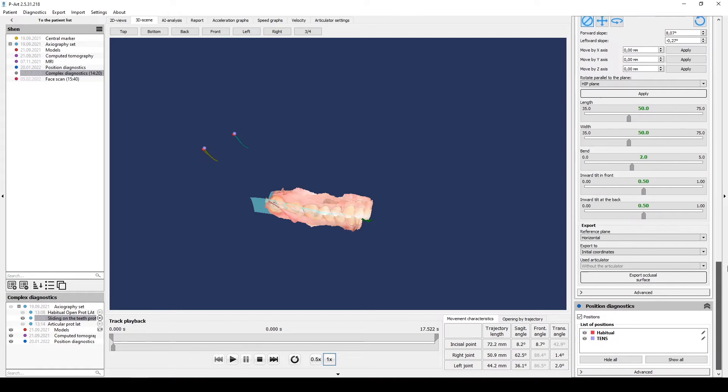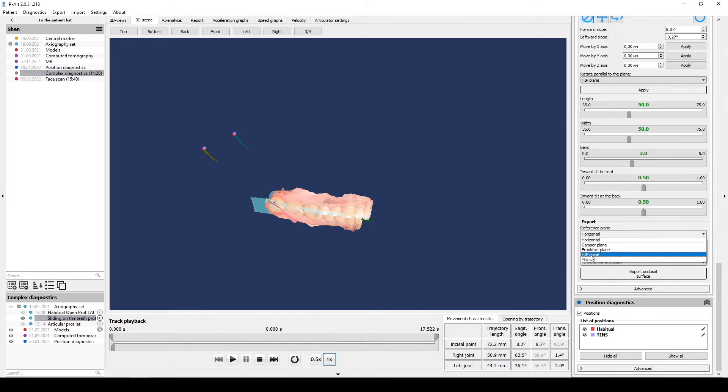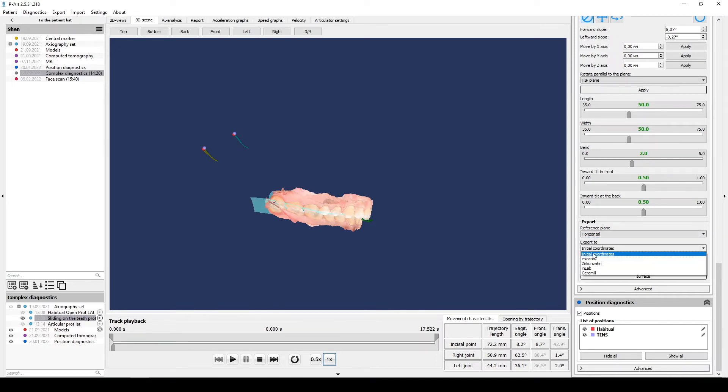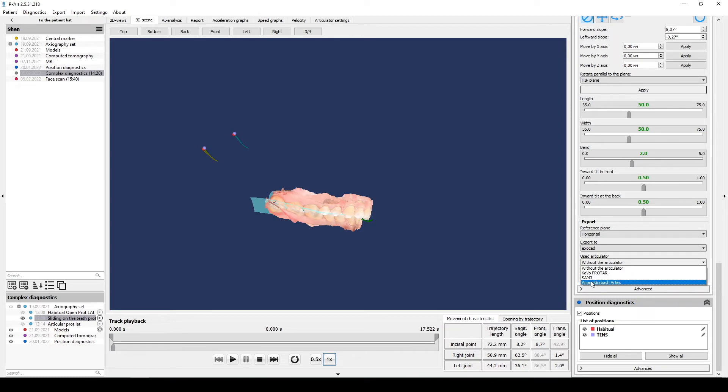After that in the bottom Export menu, select Reference plane. This plane must match with the plane we choose for export individual models. Be careful. Then we choose Modeling program and Articulator we used for individual models export. Very important.